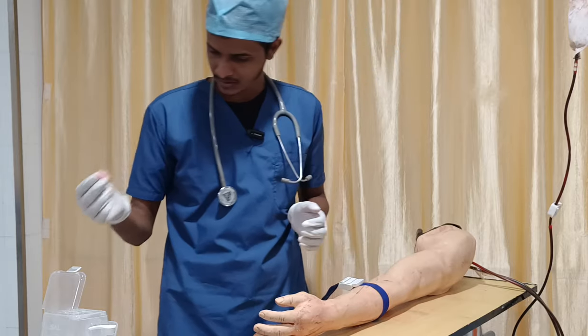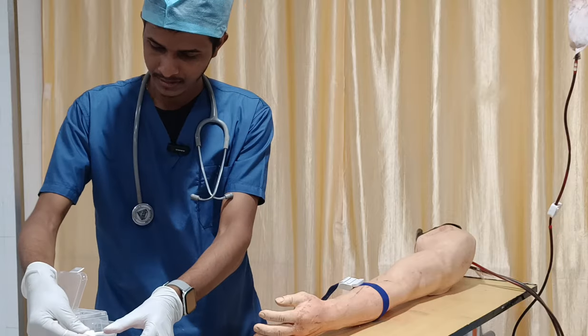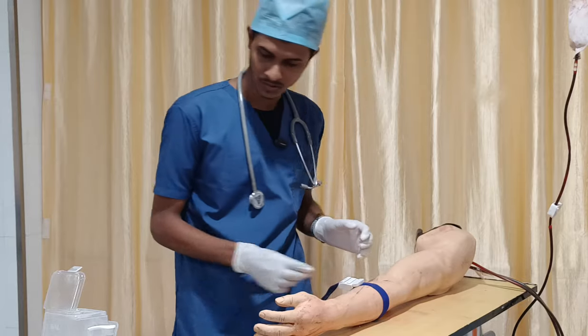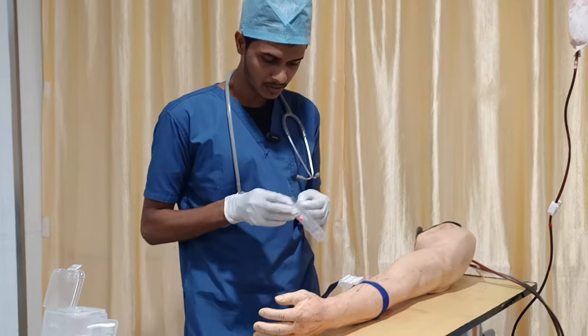The first gauze you have to place in the kidney tray. Then again I am taking a second one. I have to clean from the center to the periphery. Likewise you have to do it 1, 2 or 3 times. Place it in the kidney tray. Likewise, then you have to take your cannula.